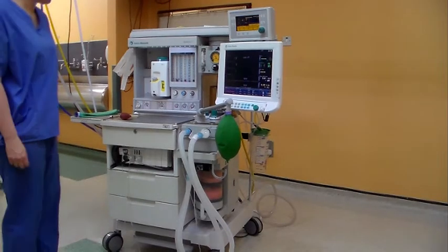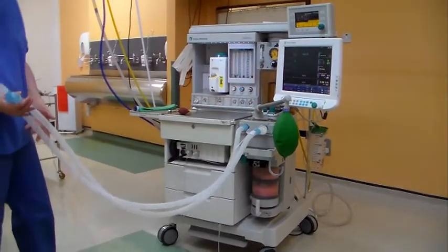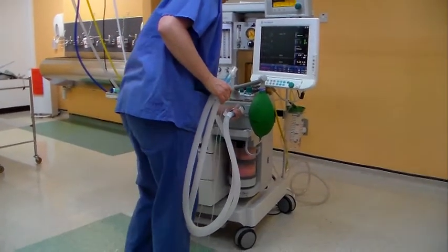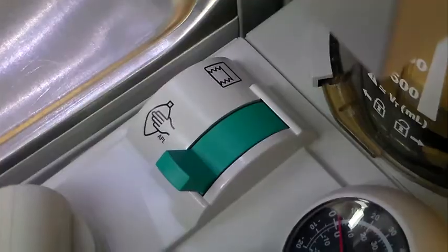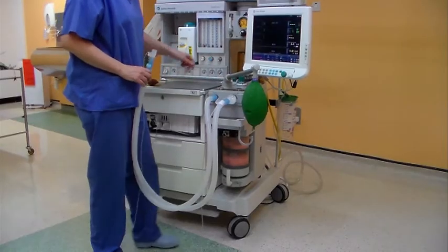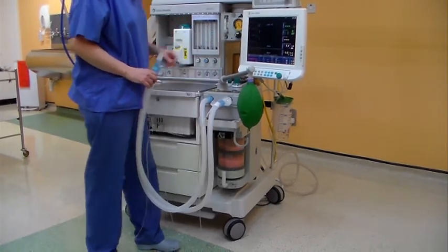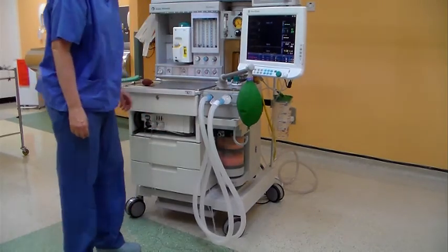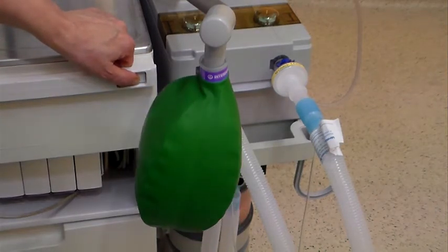The circuit leak check. Inspect the breathing system for correct configuration and for damage. All connections should be secured by push and twist. With the bag vent switch still in the bag position, turn the APL valve to the closed position. Occlude the patient Y piece. Inflate the rebreathing bag to 30 centimetres of water and check the pressure gauge.